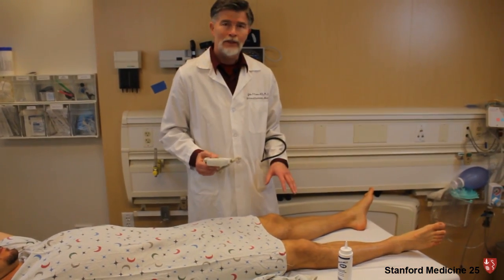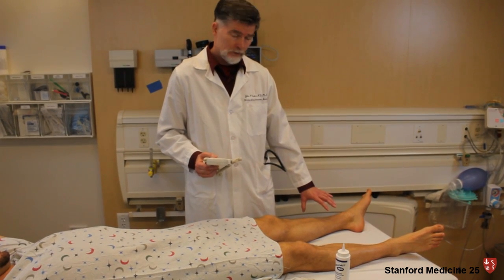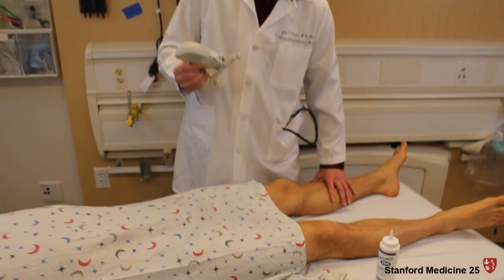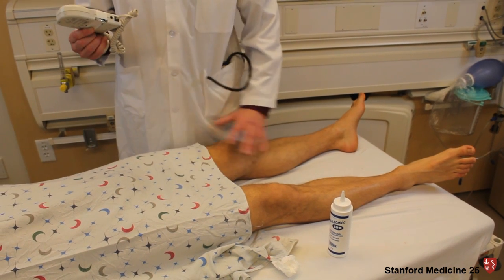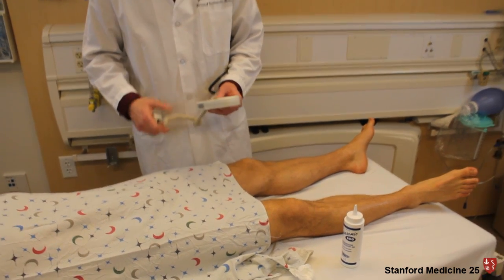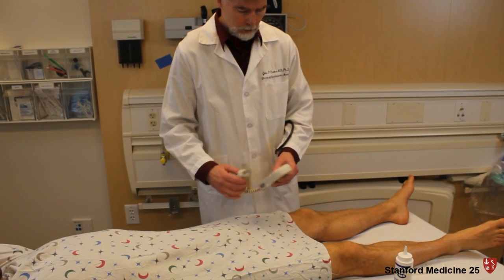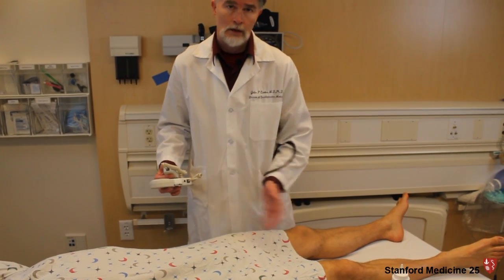To complete the venous examination, you have to move up the lower extremity. Do the same thing over the popliteal space — listen for the popliteal artery signal with your Doppler, then squeeze the calf and you should hear a robust signal of venous return. You'll also do the same thing at the femoral artery: put the Doppler probe over the femoral artery, hear a signal, then squeeze the thigh and you should hear a nice venous augmentation.